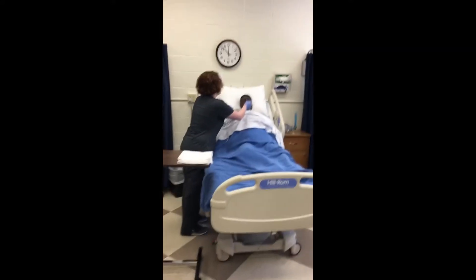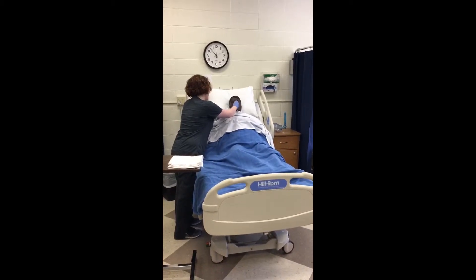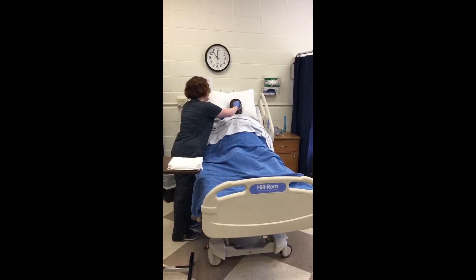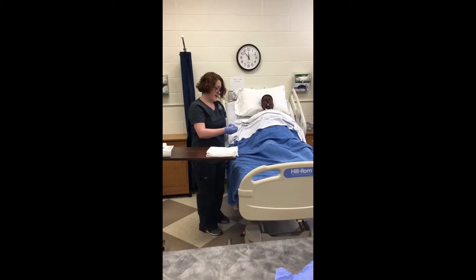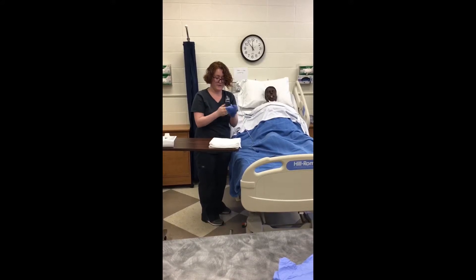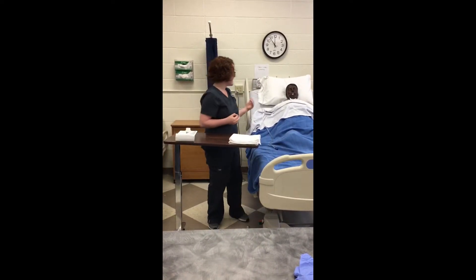Then I'm going to insert the tube along the floor of the nasal cavity — not using suction at this time — and perform intermittent suctioning while rotating for about 10 to 15 seconds until it comes out. After that is completed, I'm going to disconnect the tubing, remove it in my gloves and throw it away, perform hand hygiene, and assess the client for how they went through the procedure and document all relevant data.